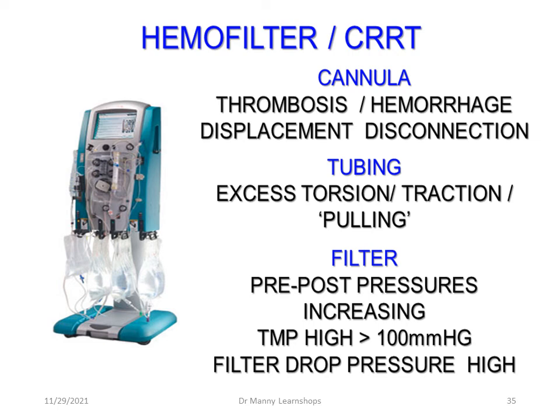If you're not familiar with CRRT, as I mentioned previously, have a look at CRRT with the Dr Manny Learnshops. They provide you a lot of information that is fairly simple and straightforward to follow. Using the Prismaflex or the Fresenius unit.